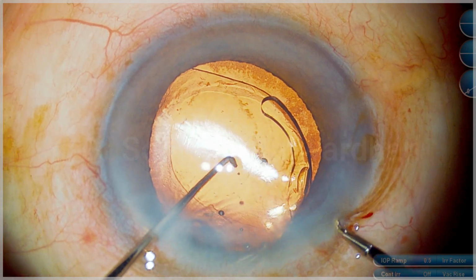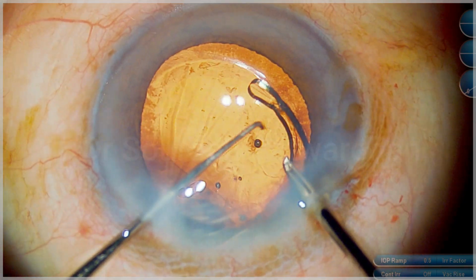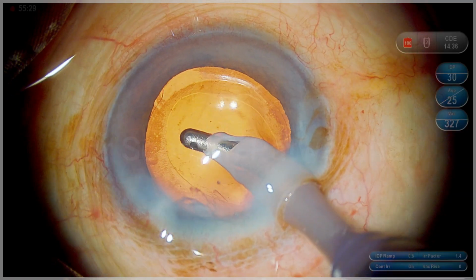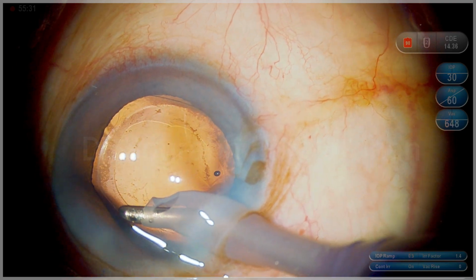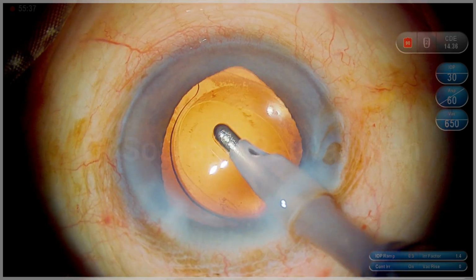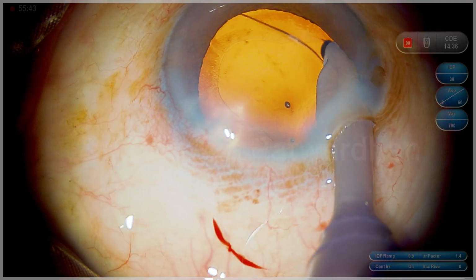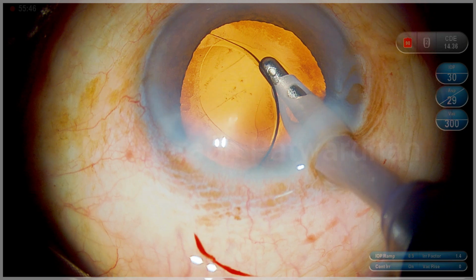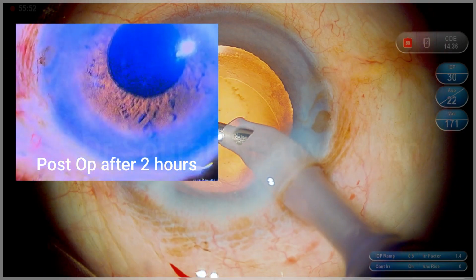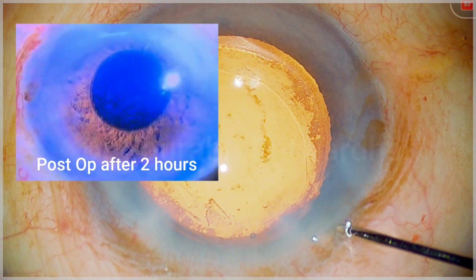So when you watch the surgery again, you can find that each and every time I'm using the same principles. Avoid excessive deepening or shallowing of the anterior chamber, avoiding hydrodissection. I use Patwardhan's sideways trenching method in this case. This is a really useful technique for denser cataracts like these ones where the patient waited for a very long time. Most often, of course, we get posterior polar cataract in younger patients because they present early, and in those cases, you can just do the layer by layer method of removal of the lens matter.